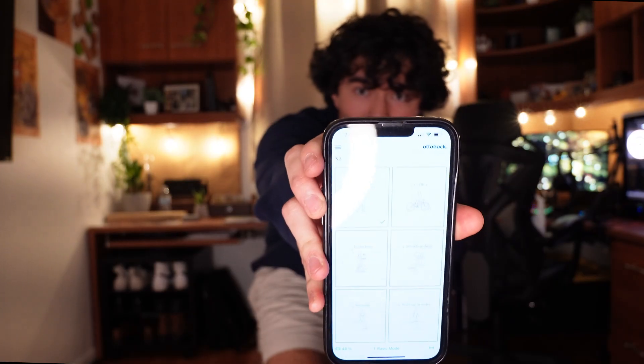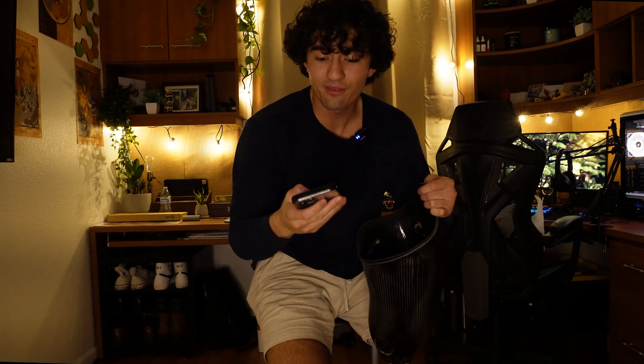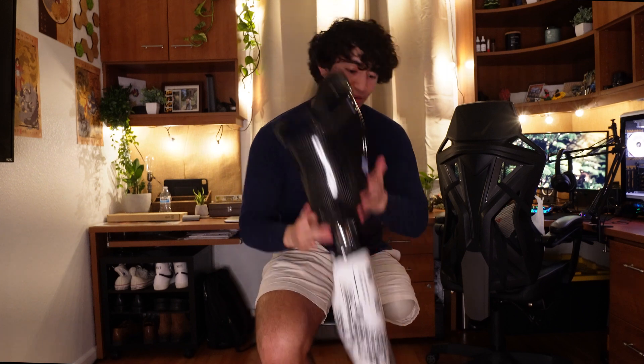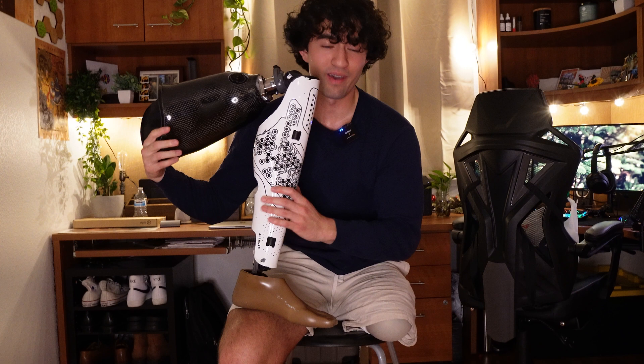As I got older and wanted to go hiking, camping, and fishing, I had to upgrade, so I got the Genium X3, which is what I'm wearing right now. This is the best prosthetic I've ever had — five-day battery life, you can run, bike, and swim in it. There's also an app where I can change modes, like switching to biking mode. The functionality of the Genium X3 is just overall the best I've ever had. The cost was a whopping $120,000, making it the most expensive of the batch.